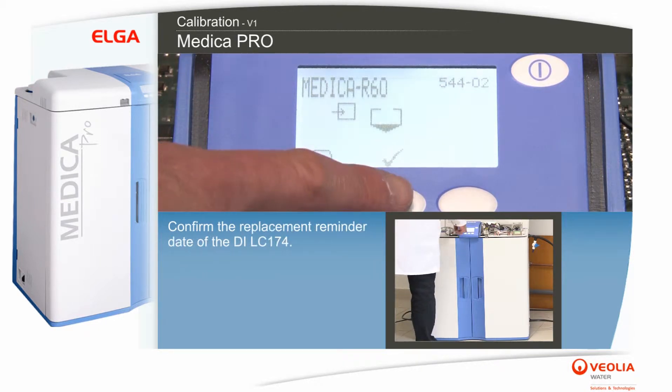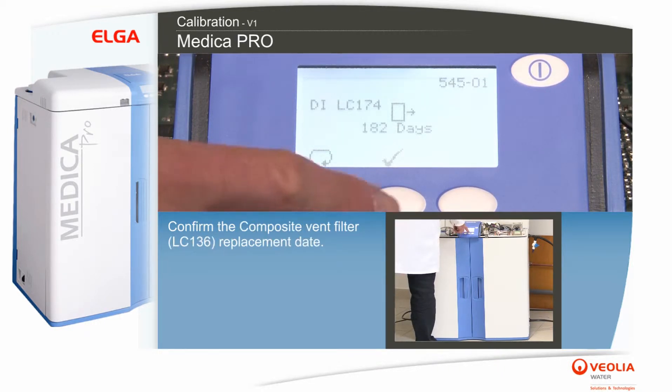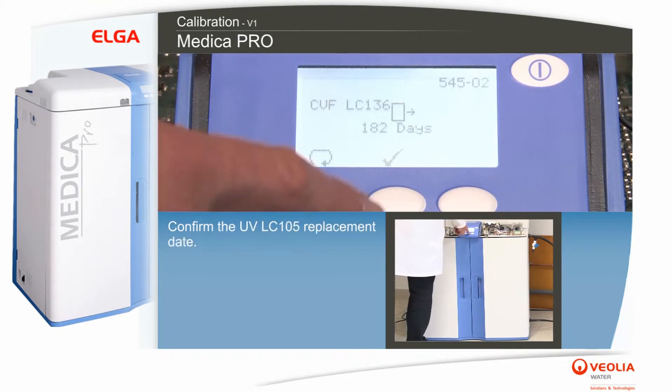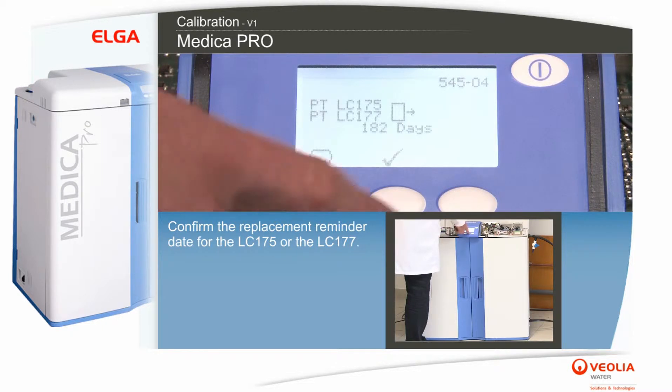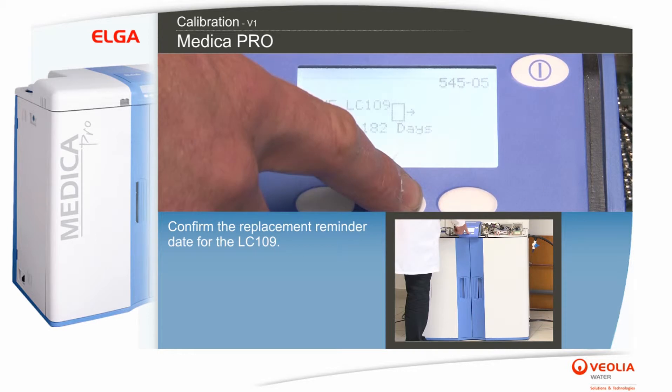Confirm the replacement reminder date of the DI LC174. Confirm the composite vent filter LC136 replacement date. Confirm the UV LC105 replacement date. Confirm the replacement reminder date for the LC175 or the LC177. Confirm the replacement reminder date for the LC109.